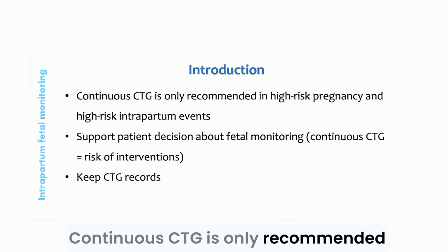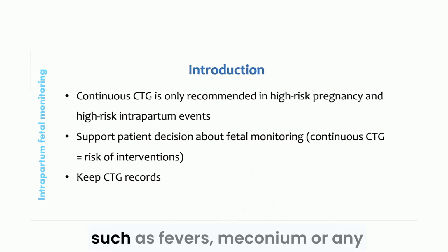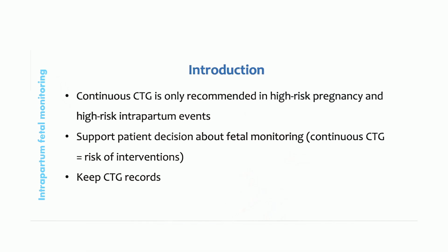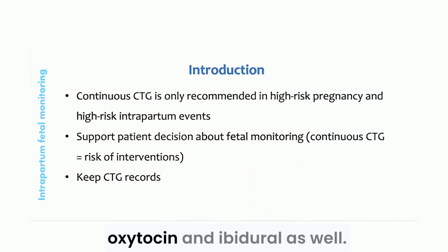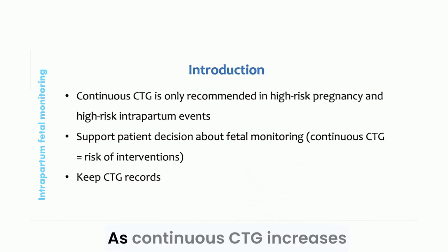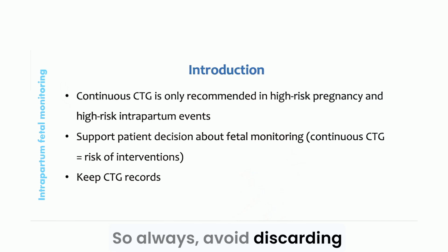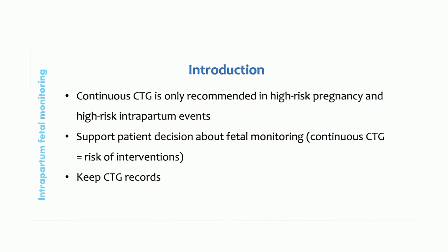Continuous CTG is only recommended for high-risk pregnancies or in high-risk intrapartum events, such as fevers, meconium, or any change in maternal observations that is concerning to you. We also do continuous CTG with oxytocin and epidural as well. It is important to support patient decision-making regarding fetal monitoring, as continuous CTG increases the likelihood of interventions. Maintaining CTG records is essential for documentation, so always avoid discarding CTG records.